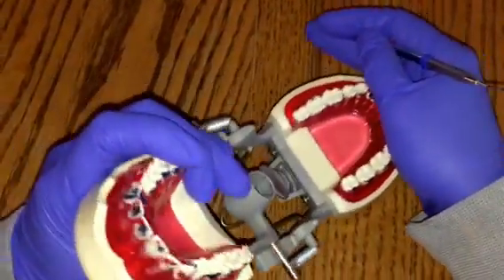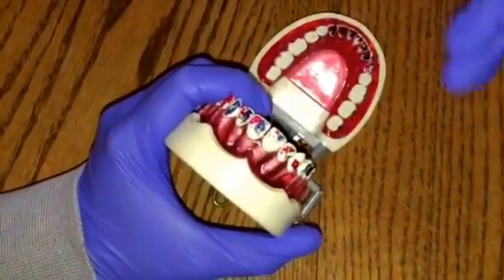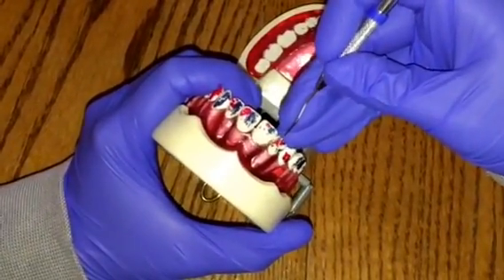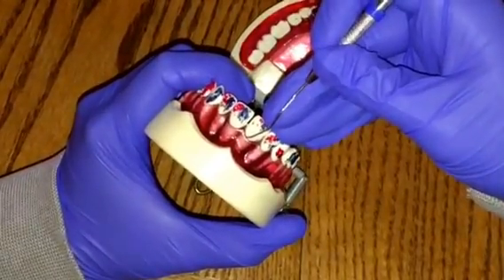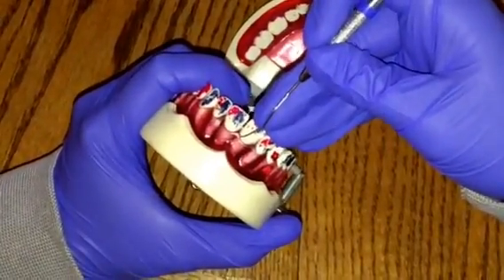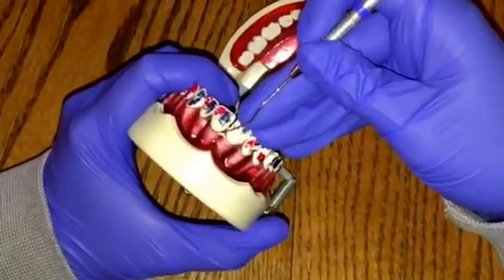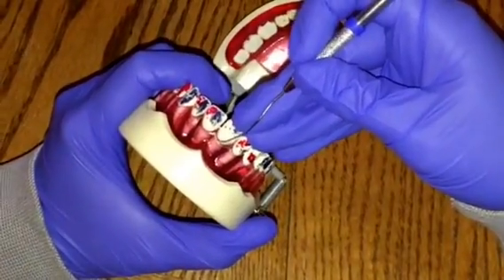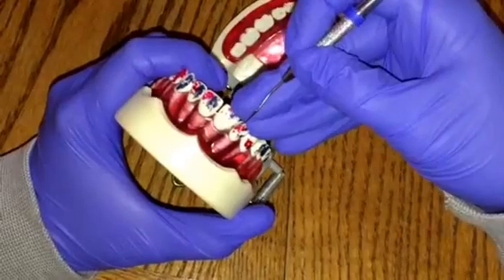Lastly, let's move to number 8 and demonstrate your technique again. So choosing the correct end here, when you're starting across midline, look at your fingers right how they are right now. That is not a light pen grasp. Do you notice anything wrong with this? This is where this can cause fatigue. This is not a light pen grasp. Your index finger and thumb should be rolling the instrument and always kept apart. So you want to have them kept apart like this and not close together.